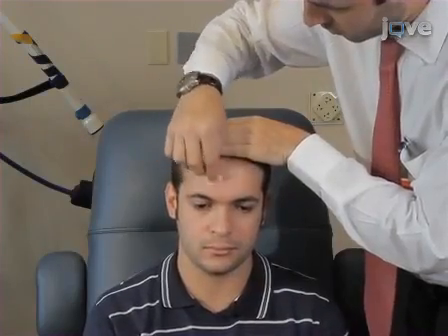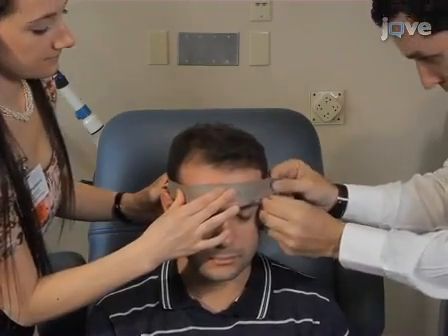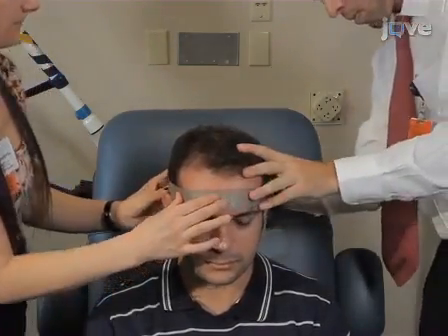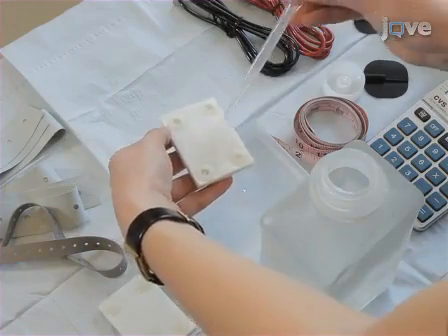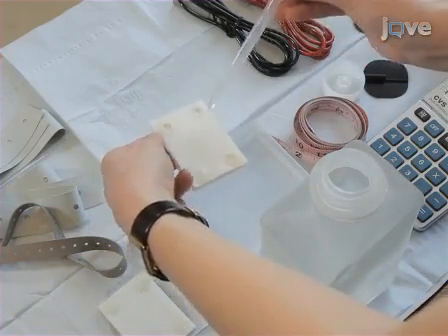Before placing the electrodes, place an elastic or rubber head strap around the subject's head under the inion. This will serve to secure the electrodes and reduce movement during stimulation. Next, prepare the sponges by saturating each side with saline solution. For a 35 cm square sponge, approximately 6 ml of solution per side should suffice.